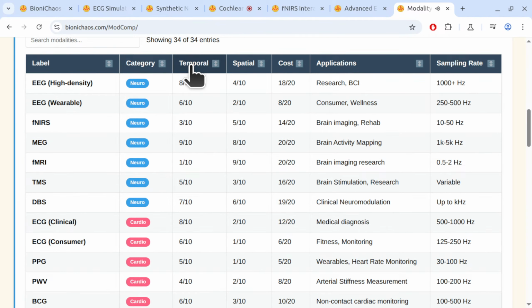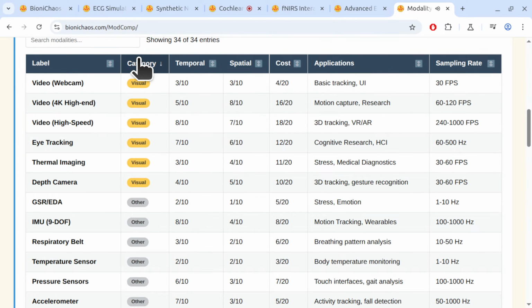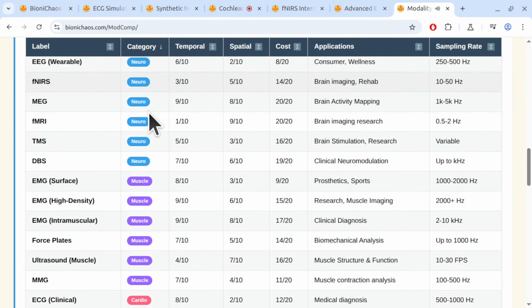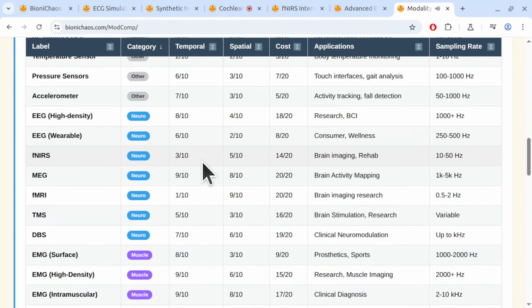It is a challenge. They often use it to see which brain regions are activated during a sustained task, rather than the exact timing of individual thoughts. It's about the location over a period. Okay. And sometimes they combine it with other methods like EEG to try and get the best of both worlds, the where from fMRI and the when from EEG. The cost reflects the huge superconducting magnets, the complex setup. It really is a spare no expense approach to spatial detail. Even if the when is significantly delayed.